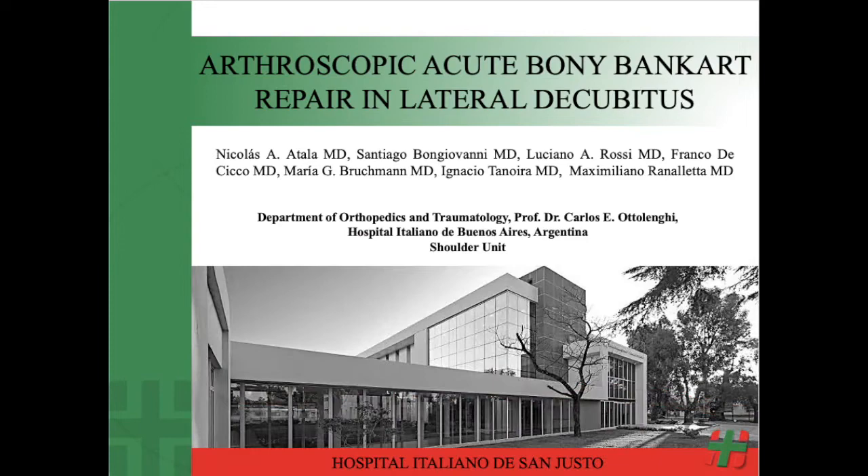We present our arthroscopic acute bony Bankart repair technique in lateral decubitus.